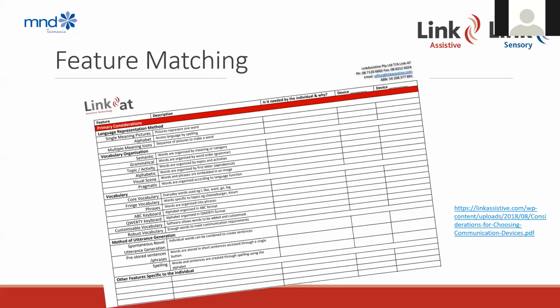So feature matching is a process where we think about what are the features or the things that the person needs in an assistive technology solution. Thinking broadly about how we represent the language, what sort of vocabulary, how we access that. It takes you through all those different considerations and allows you to compare different options, thinking about, you know, this option has these features, this option has these features, and seeing if there's anything missing in those, or giving you that opportunity to weigh up which features are most important to the person. So that's kind of the assessment process that you would go through, and this is a tool that you can use to help you do that.